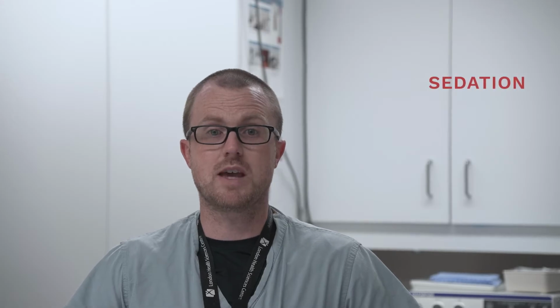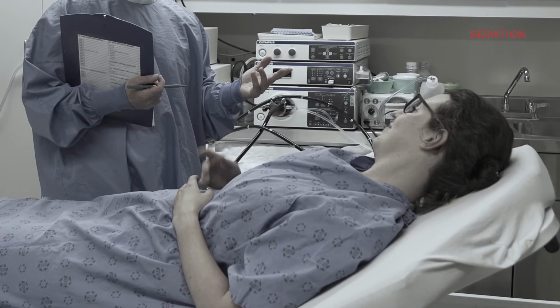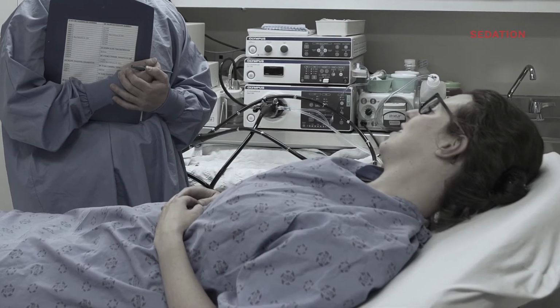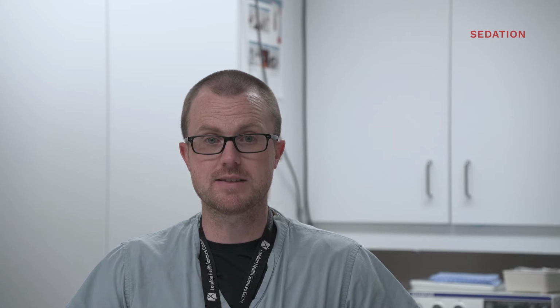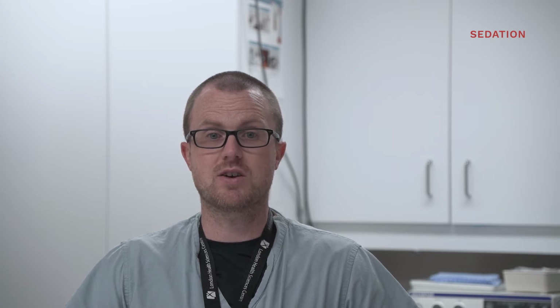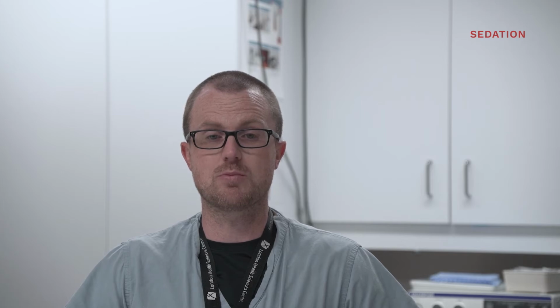The endoscopist should be capable of providing endoscopy with or without sedation. It should be patient preference that dictates the degree of sedation for what is a highly invasive test. The goal of quality endoscopy practice is not to minimize sedation, but to be able to provide endoscopy with minimal discomfort, regardless of the degree of sedation desired by the patient.